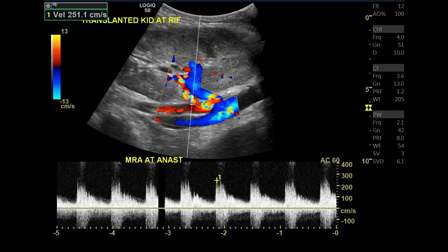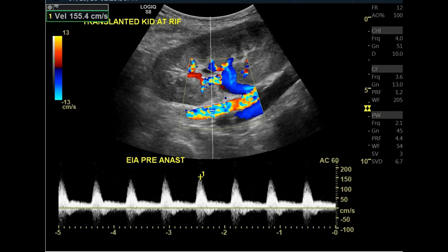After that, we scan the main renal artery at the anastomosis to the iliac vessel. Here, the anastomosis is done with the external iliac artery. We take the velocity at the anastomosis, which is 251 cm/s, and we compare it to the velocity at the external iliac artery pre and post anastomosis.